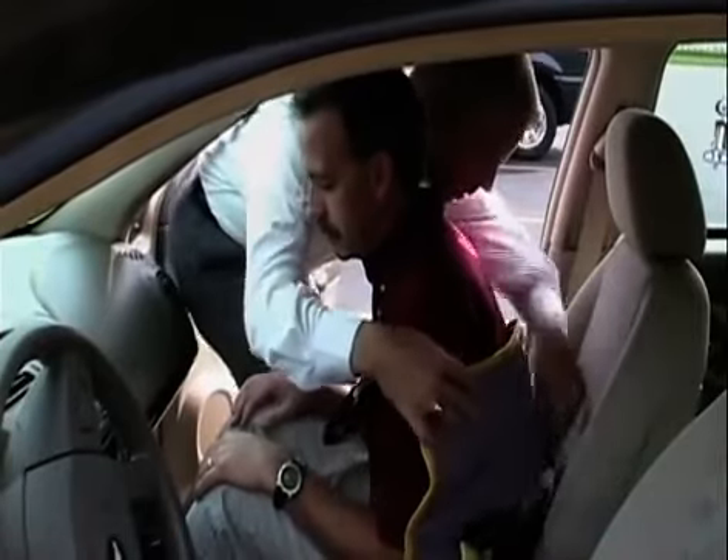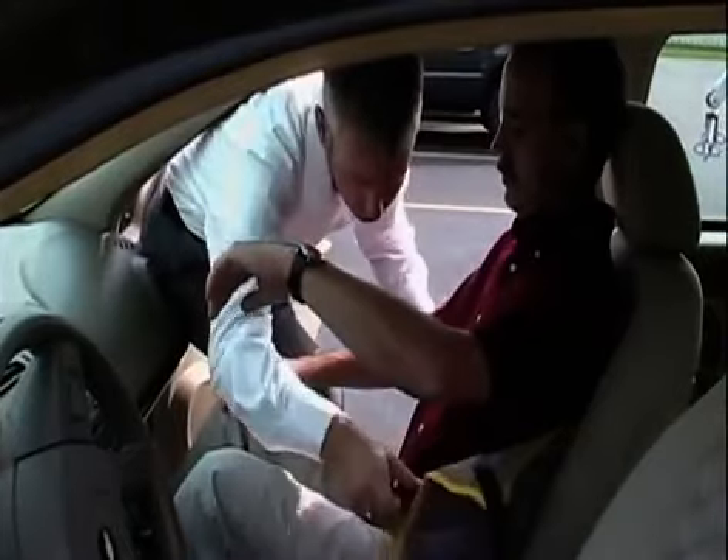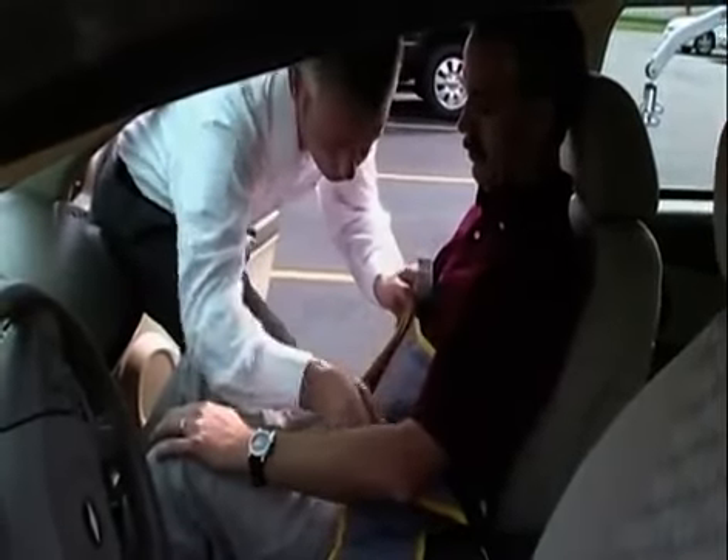Now, after I've done so, I'm going to go ahead and lean you back. If you can lift up your arms for me, that would be great. I'm going to draw these two straps across. There's actually Velcro on them, so I'm going to wrap that in place, and that'll help to keep it comfortable and help to lift you.